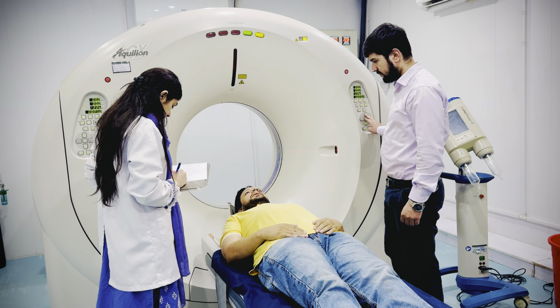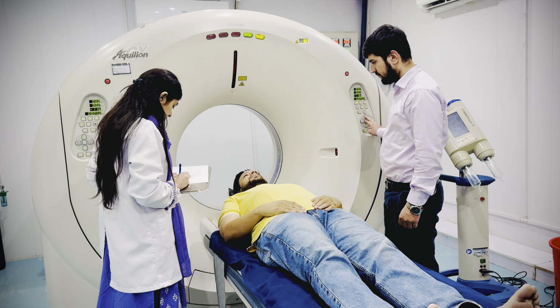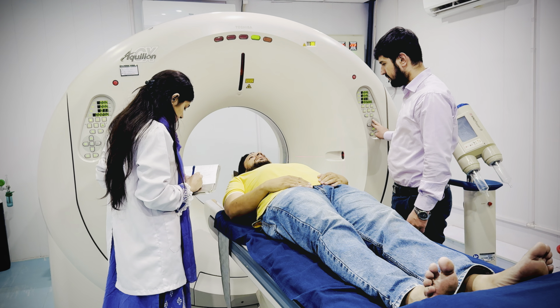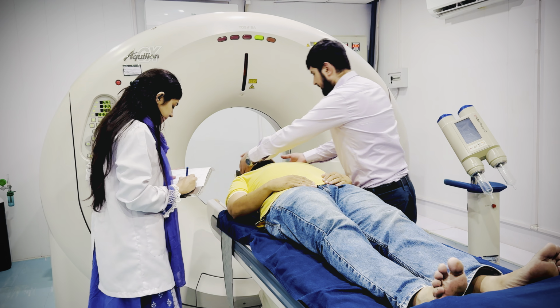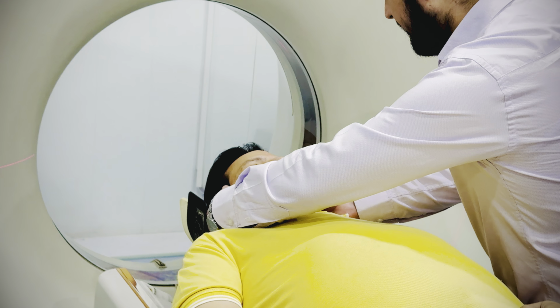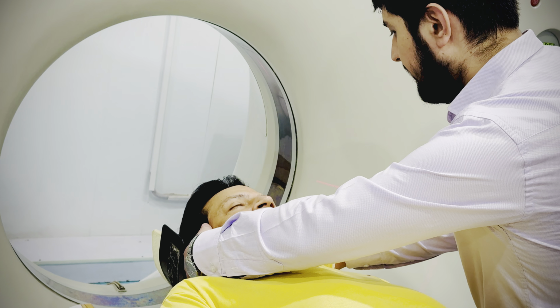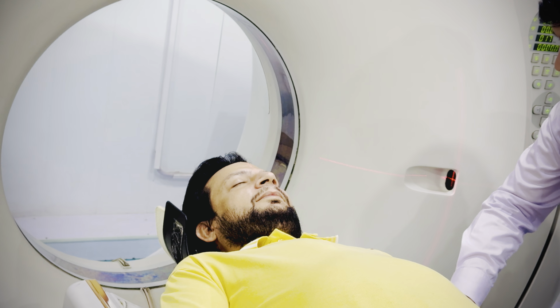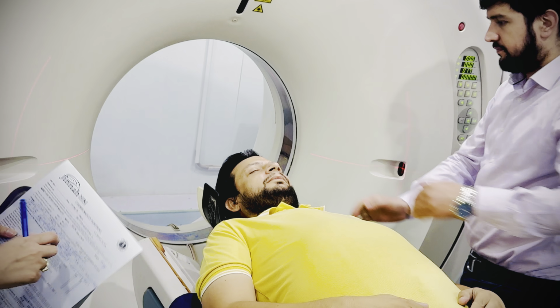Secondly is the patient positioning of the CT brain. The patient should lie on their back, as you can see, also known as the supine position. The patient's head should be placed on the head holder or with a cushion to prevent motion. Instruct the patient not to move at any point during the scan to reduce the motion artifact. If the patient is non-cooperative, tie the head with the headband.